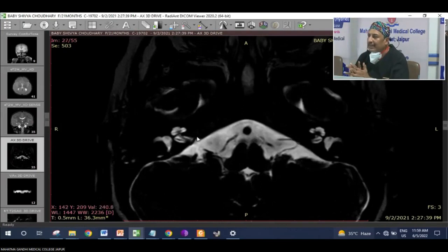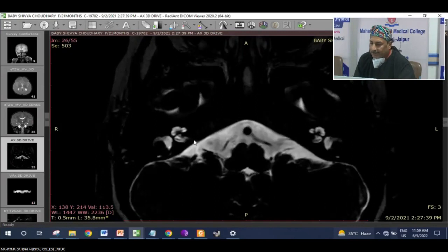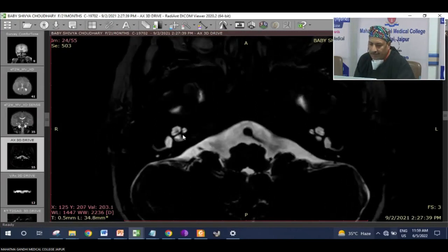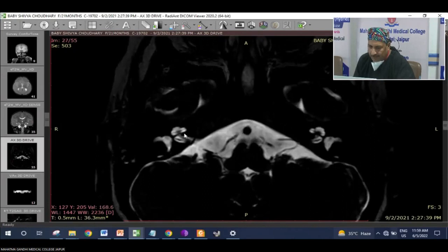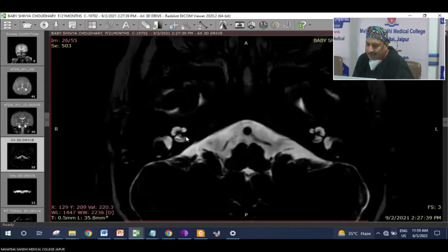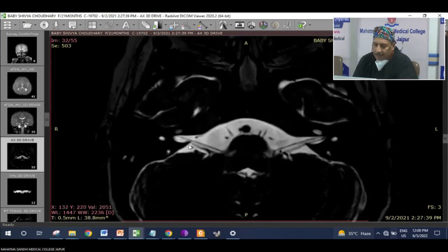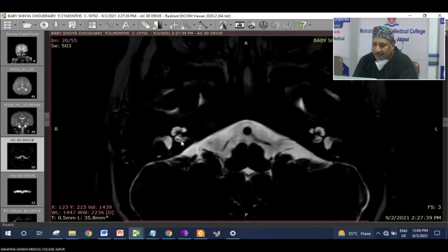In situations like ossification, post-meningitis, post-traumatic, post-otosclerotic, there are many etiologies which can contribute to obliteration of the cochlea. And complete obliteration rules out the possibility of a successful implantation, though the surgical technique has advanced now with the advancement in the electrodes, wherein we can implant even the very difficult ossified cochlea to a certain extent, not optimum, but to a certain extent. Otherwise, the ABI is the final answer.